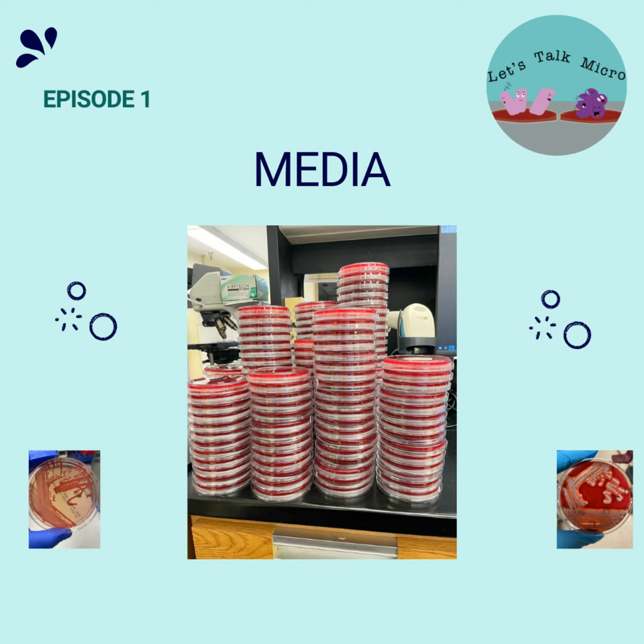And I have a great story about Pasteurella aerogenes. This happened a few years ago. I was working in bacteriology. And normally when you start seeing Pasteurellas, you get your classics, canis and multocida. And what's Pasteurella? It's a gram-negative coccobacilli that is normal flora in animals. Multocida can be normal flora in cats and dogs. Canis is for dogs. And there's another Pasteurella, which is Pasteurella aerogenes.